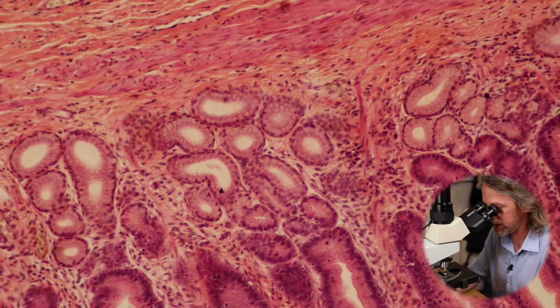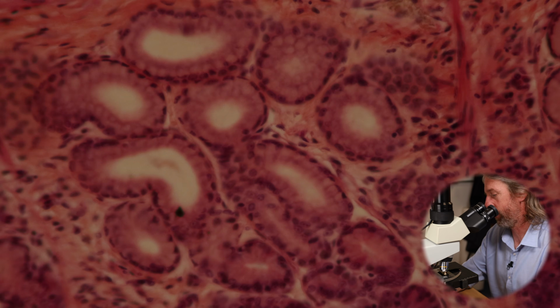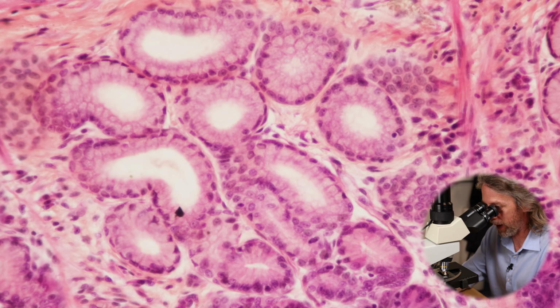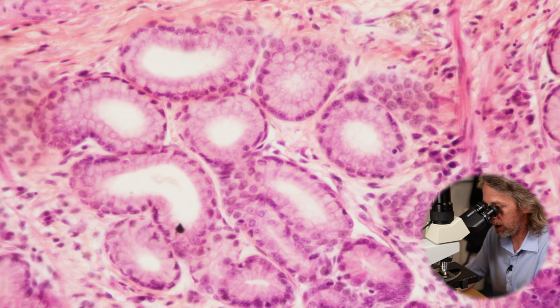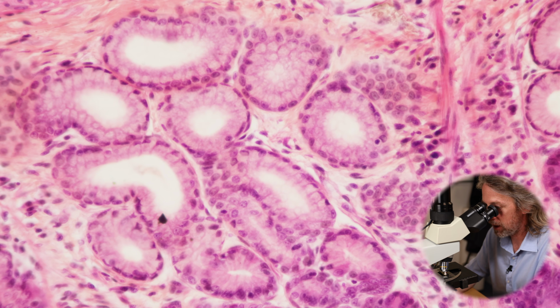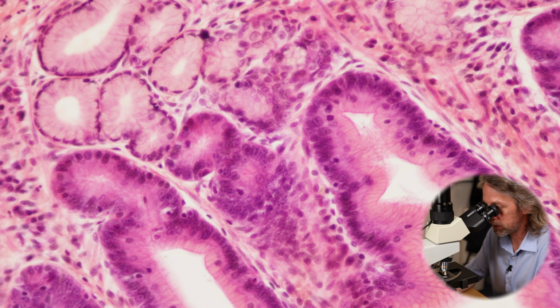Now those gastric glands actually look very organised, and they are simpler. They're not the same as what we saw in the body of the stomach. The same things aren't going on. So in the pylorus, we're more likely to see lots of neuroendocrine cells, so cells that are chucking out endocrine signals, hormones that are acting to have effects on the other cells of the stomach. We're still seeing lots of mucus glands, and we might see some parietal cells and what have you.